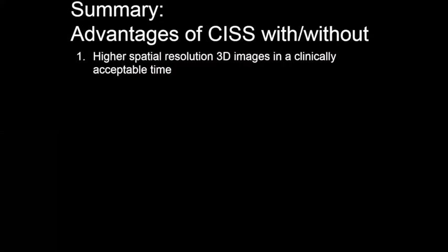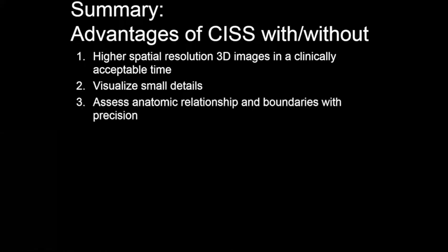So in summary, high resolution 3D imaging, including CISS imaging before and after contrast, and it's important to be able to compare the two sequences to assess when there is in fact enhancement, can be acquired in a clinically acceptable time period.